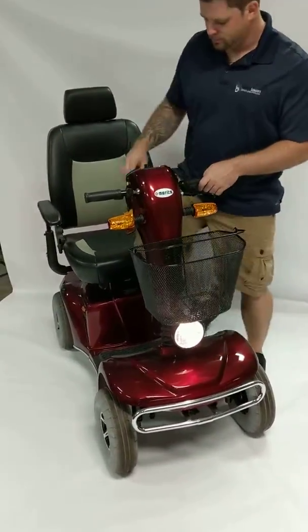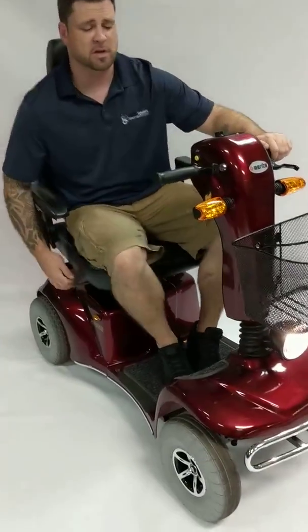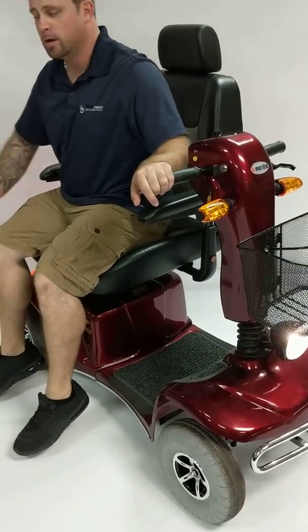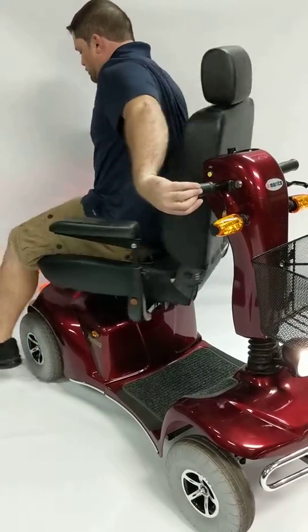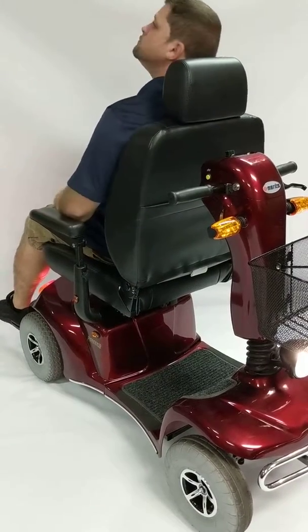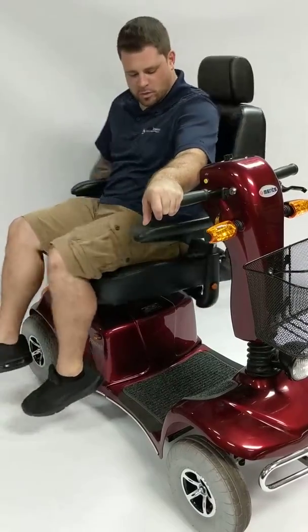On the back side of the scooter, I just want to show you this for transferring purposes. I can transfer and get off the scooter this way. Or I can sit back, enjoy the sun. You can swing all the way around.